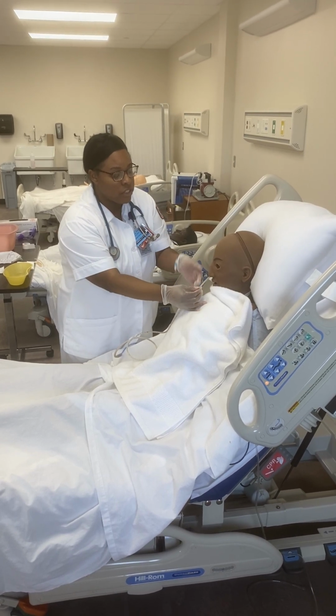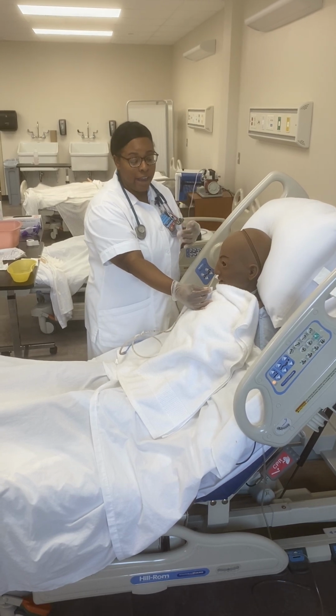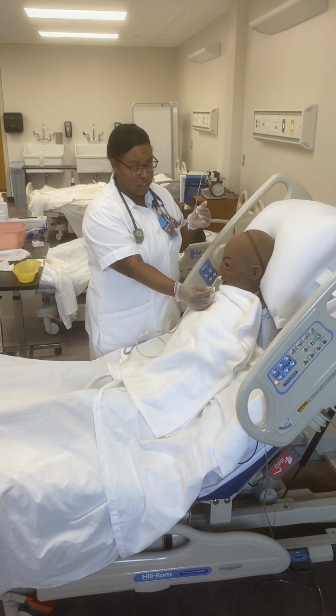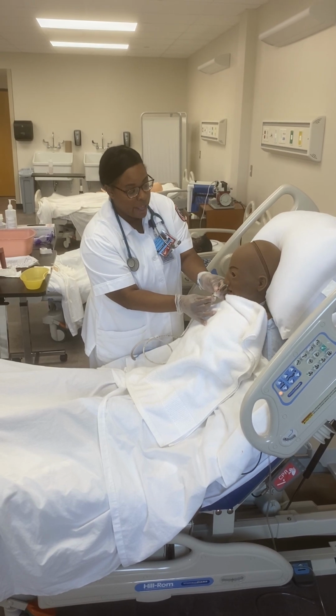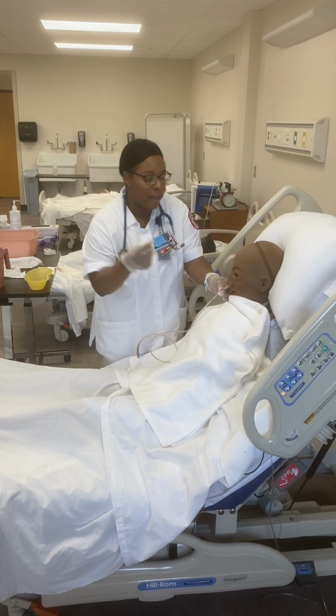If my patient starts to cough or become cyanotic or have an inability to talk, I will discontinue the procedure and notify the physician. My patient hasn't had any signs of distress, so I'm going to continue with the procedure and advance the tube. I'm going to temporarily secure it with tape.